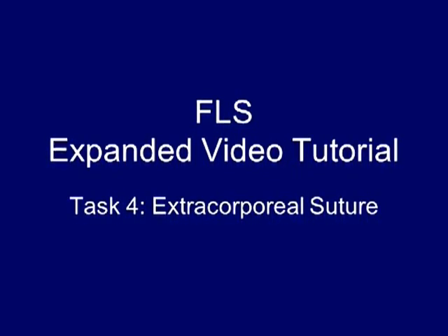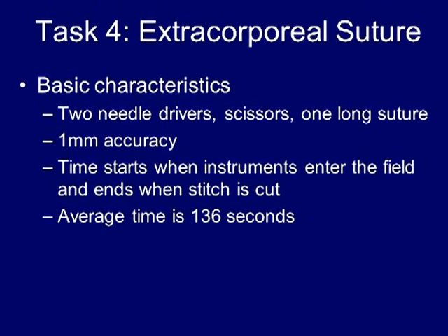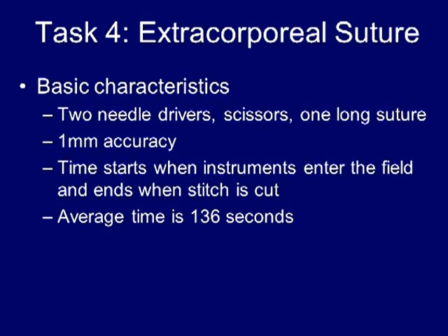Task number four: the extracorporeal suture. For this task, you'll be given two needle drivers, one pair of scissors, and one long suture. We recommend that you use a 48-inch suture to practice. The suture material should be 2-0 silk or something equivalent. You have to have one millimeter of accuracy in placing the needle through the black dots indicated on the Penrose drain, as will be shown in the video demonstration.